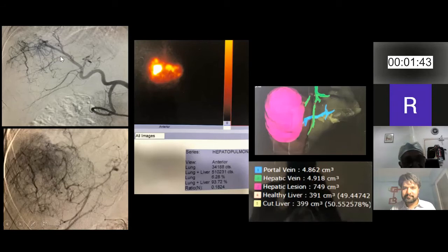Infusion deep down is very beneficial in these patients. Once the first stage is done, we take up the patient's CT scan and do what is known as a volumetry. We identify the size of the tumor and the area of the liver which we will be infusing. So the infusion liver lobe as well as the size of the tumor is calculated. We calculate the lung shunting, and based on that data, we decide the dose that has to be given to this patient and the order is placed. These medications come from Canada or from Australia, and they take anything 7 to 10 days to come.